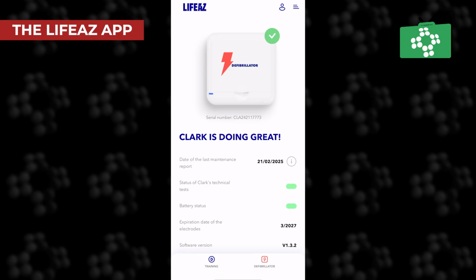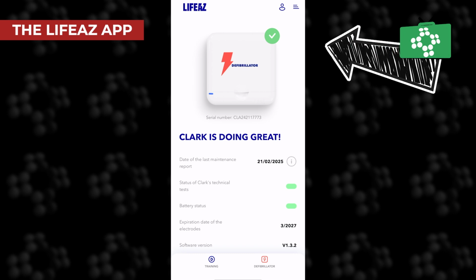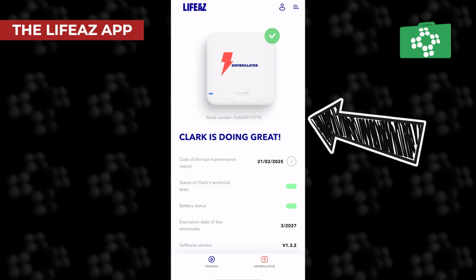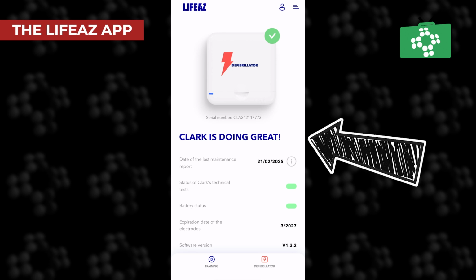So what we'll do now is have a closer look at how the app's working and the functions within the app. As you see here, this is the main page for the unit. You can see on there that there's a big green tick on the screen that shows that the unit is functioning correctly. The serial number is confirmed there. That number there is the actual serial, and it tells you that the unit is doing fine. So that's quite clear and very easy.